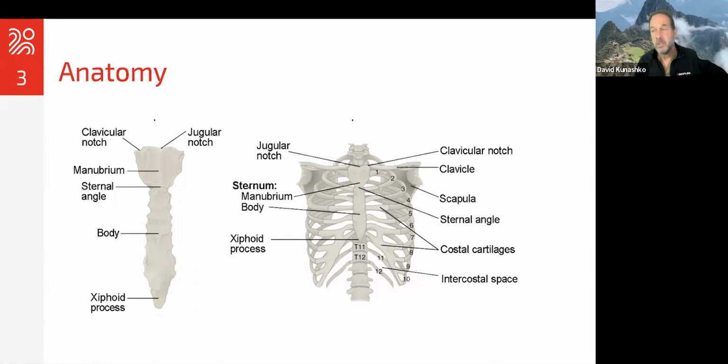Sometimes people get a little antsy about treating maybe over the heart, or maybe there's a pacemaker or whatever. That's not a contraindication. And really the reason for that is that this is light. It's not electrical current. So if there's a pacemaker, there's no electrical current being imparted into the tissue, so that shouldn't cause any issues. Not to mention, it's not going to have any negative effect on the heart. It lies pretty deep in the chest cavity, and really there's no negative interaction there either.